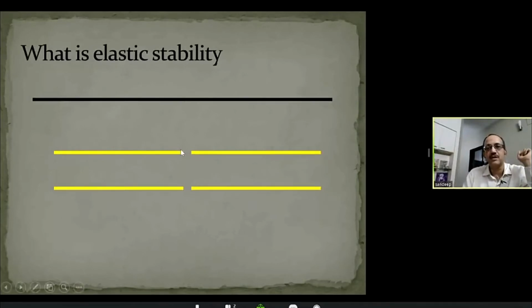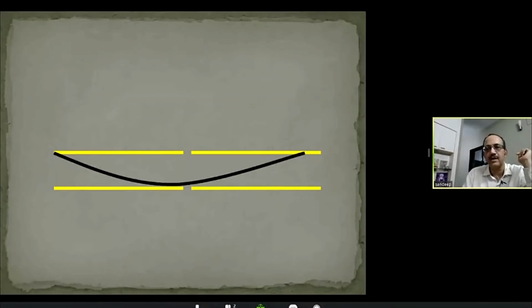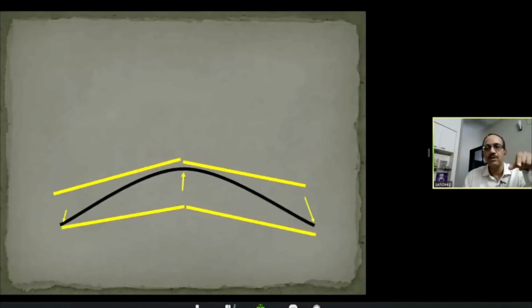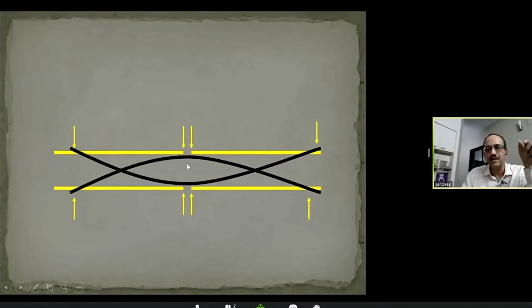The yellow here is the bone, this is the fracture, and you have this elastic nail with you, okay, the titanium elastic nail, which is the black line. Now you bend it to such an extent that when you put it in bone, it deforms bone, right? The bone actually deforms because the elastic nail is trying to straighten out. Now, if you put another nail which is pre-bent in the same amount from the opposite side, both of these elastic nails will create a sort of a spindle. And this spindle gives an excellent 6-point fixation.